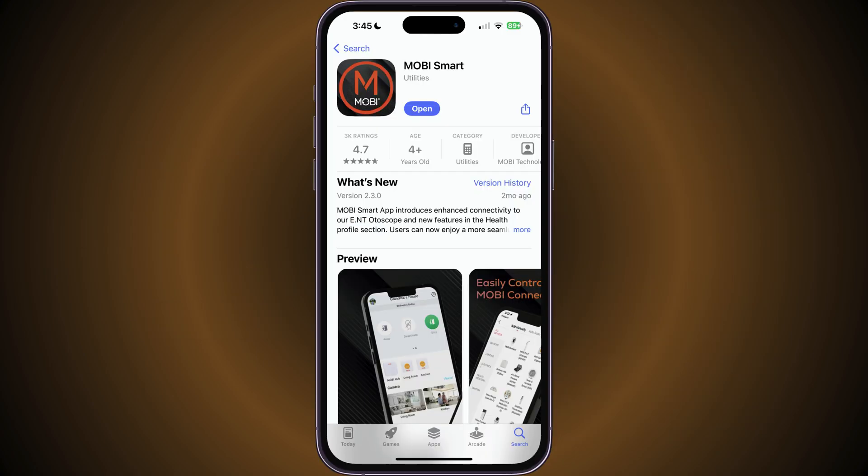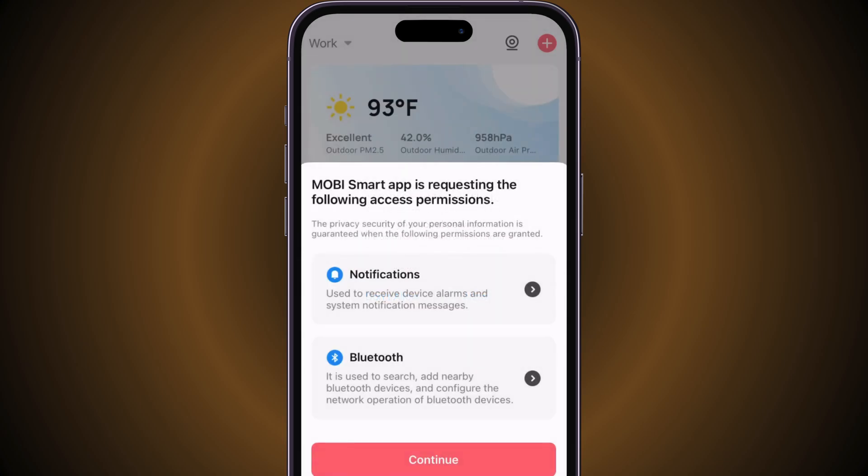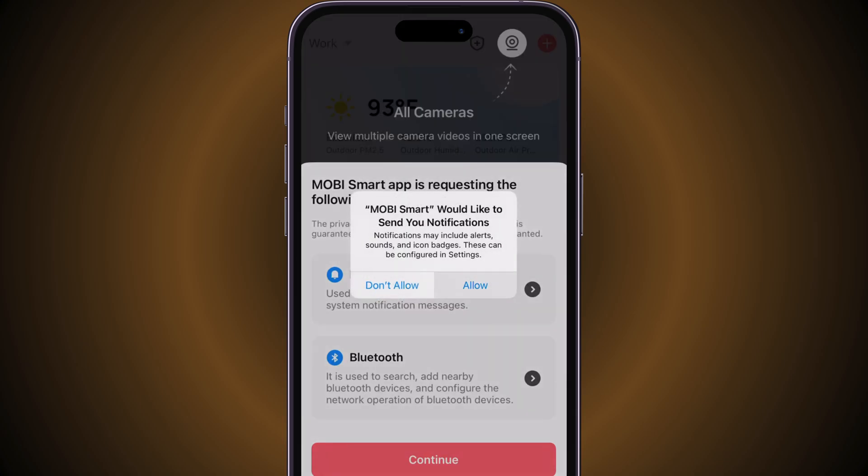To begin, download the Mobi Smart app and sign up for an account. Please accept or allow any pop-up messages that the app asks for, such as Bluetooth, location, and notifications.